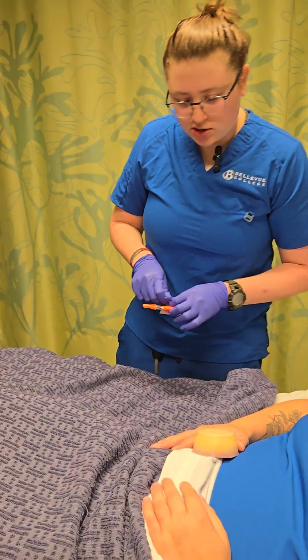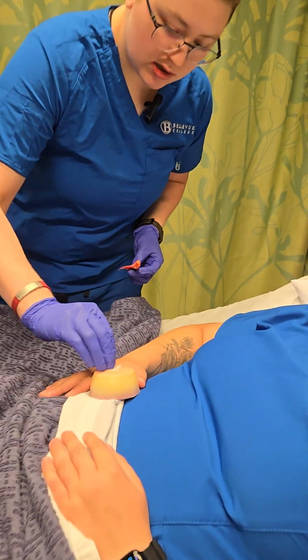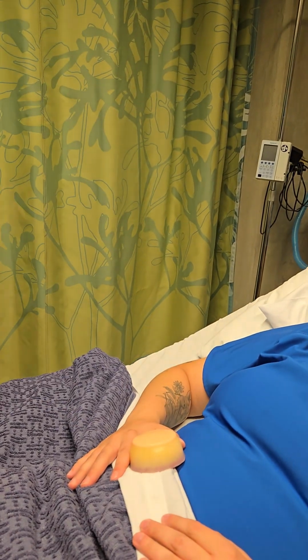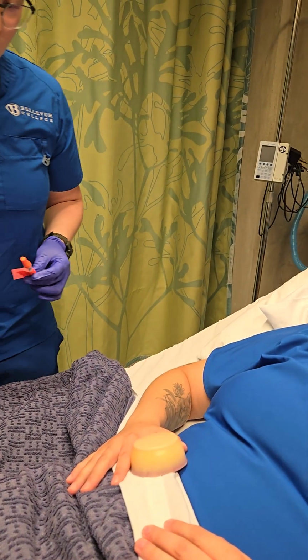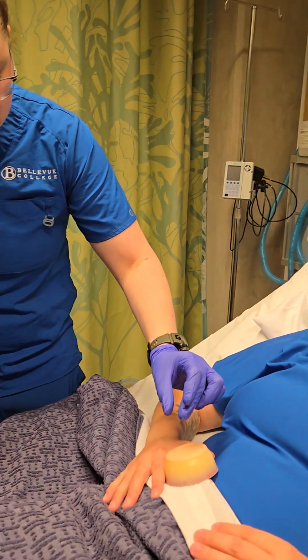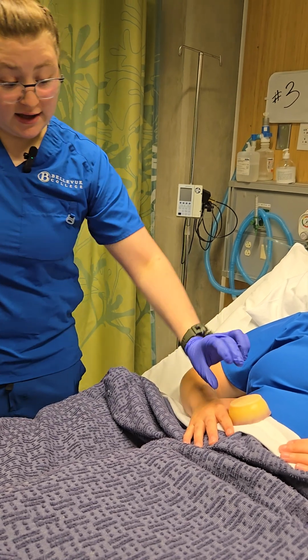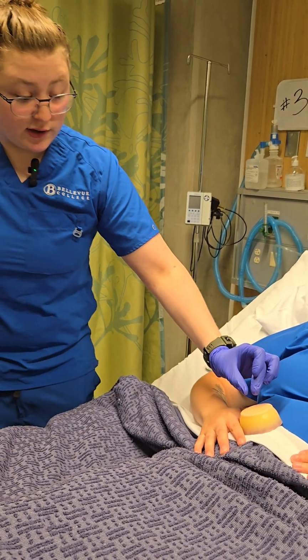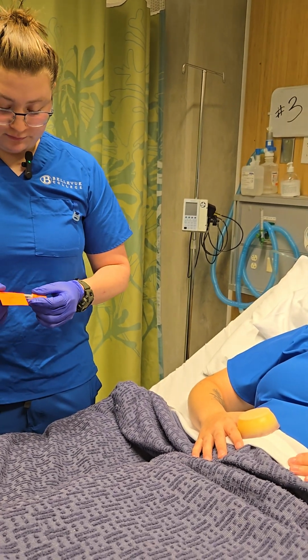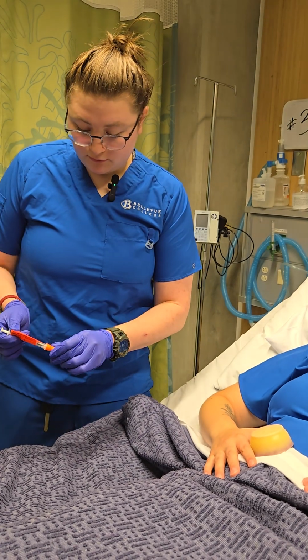So I'm inspecting. I'm making sure that the area is all good, and it's not where you last received a dose. I'm going to rub. Looking good. Okay. I'm going to let that dry. Because this is about 1 inch, I'm going to squeeze and inject at a 45-degree angle. If this were more than 1 inch thick of subcutaneous fat, then I would actually be pulling the skin apart. All right. It's dry.